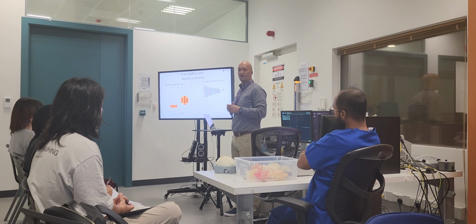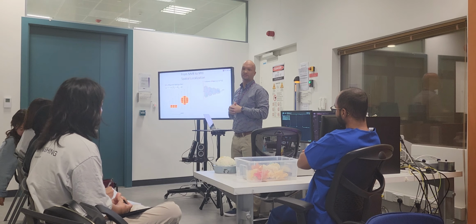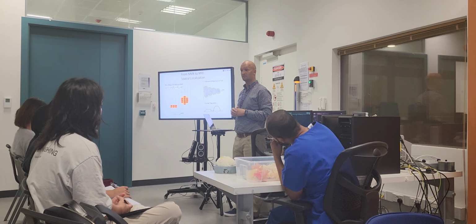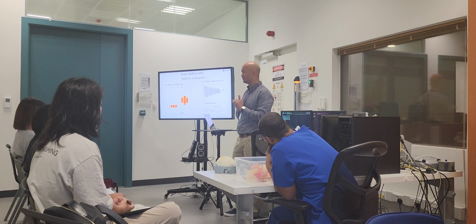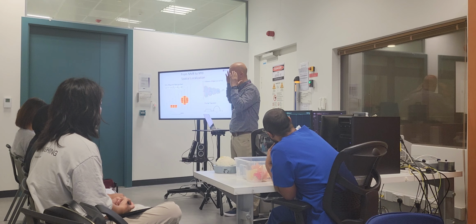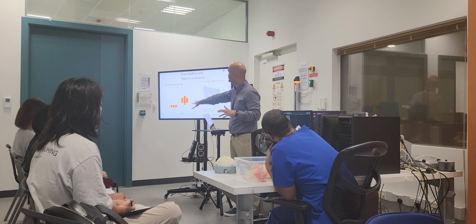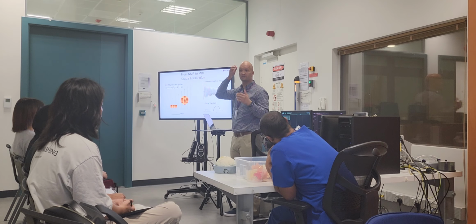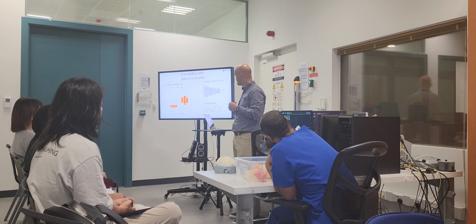Okay, here's a signal. How do we analyze it? Mathematical prism, Fourier transform. What do we get? A projection. This projection, you can think about it as if I integrated the spatial information perpendicular to the x. It's a projection.